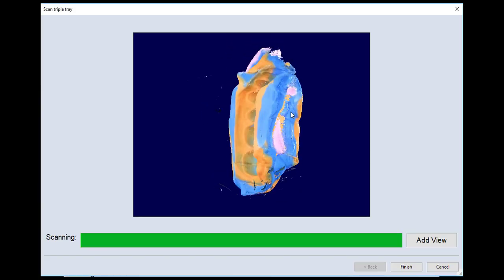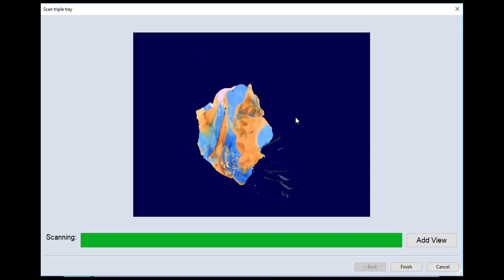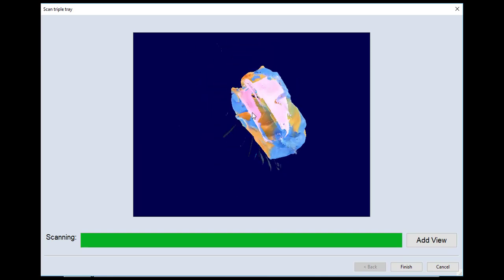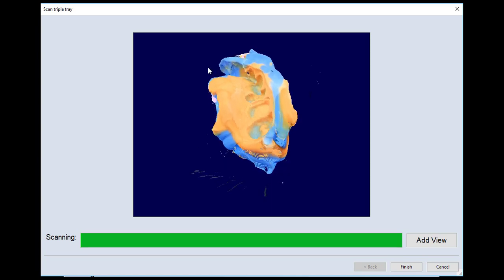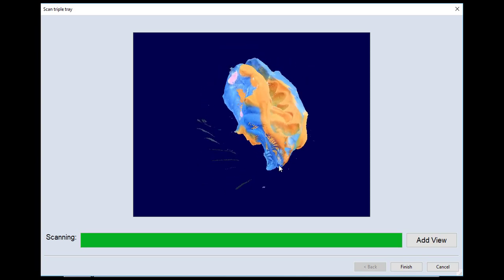With the scan now finished, we can rotate this around. We can look at our model, and obviously you're going to see that it is a color model. You have the option in your exports to export this with color or without. It'll do PLY, OBJ, or just raw STL.